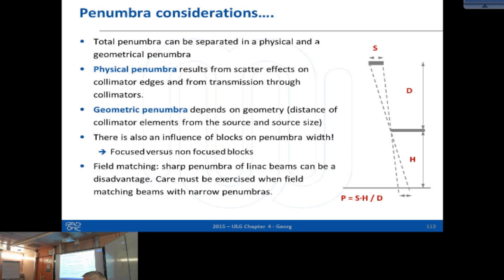How fast does one have to react in this case? Very fast. Yeah, but what's the time frame to decide? Yeah, I mean, it's hard to say, because you don't know whether the source is partially back, whether it's still fully there, and so as fast as possible. And the whole thing is a matter of training, because if the source gets stuck, the thing that shouldn't happen is that the person realizes that and calls superiors. What should I do?